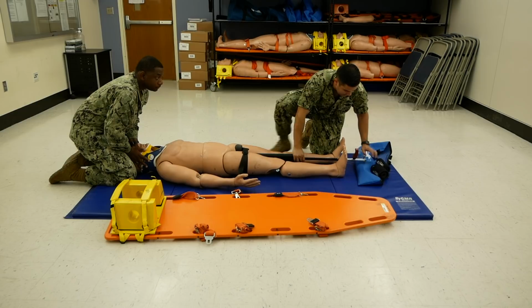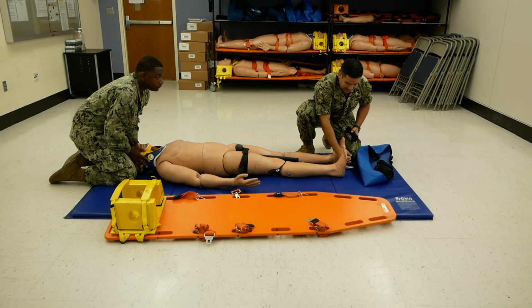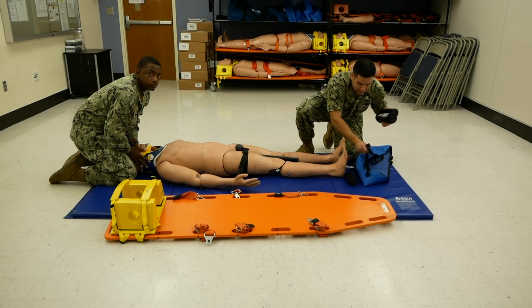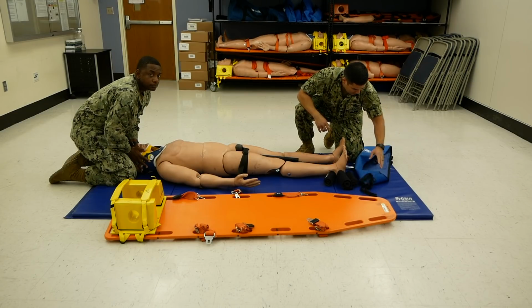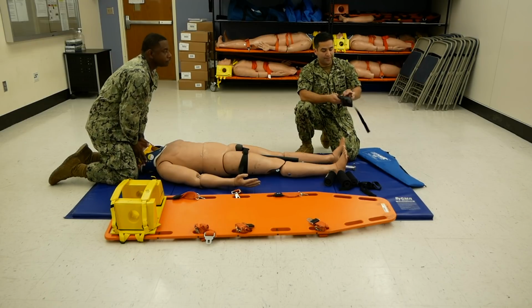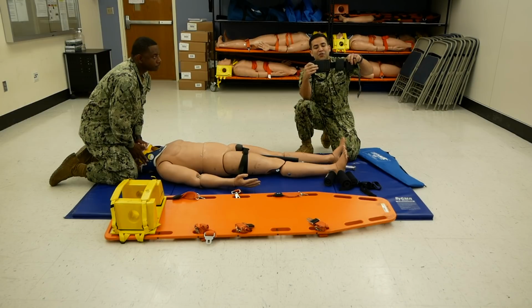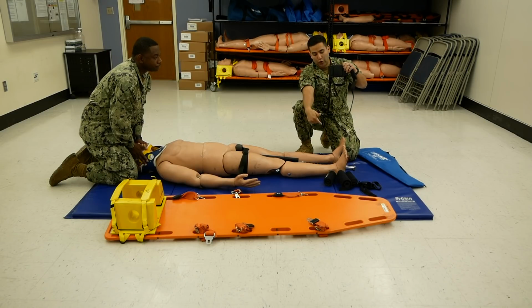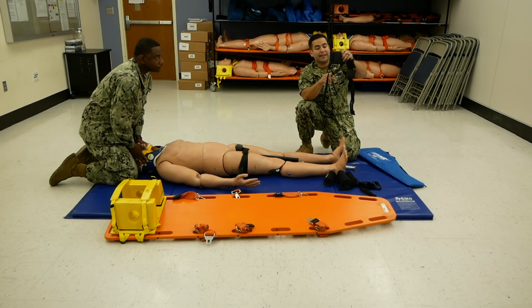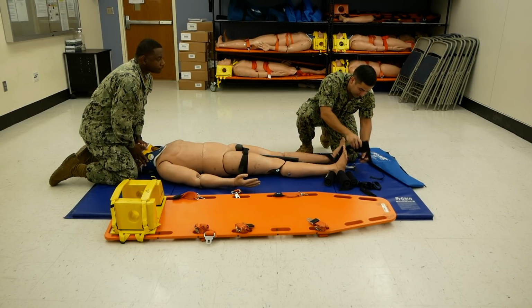Go ahead and extend the traction splint to where the lever is right at ankle level. You have your 3 cravats to secure and your ankle strap. With this ankle strap, you have a large pad and 2 smaller pads. The large pad will go on the posterior part of the patient's affected ankle, and then the loop will be hooked in to the end of the traction splint.